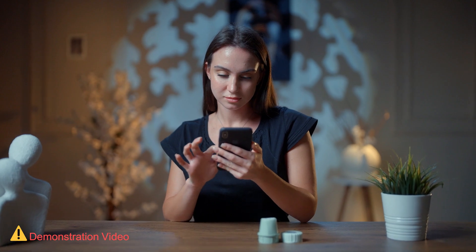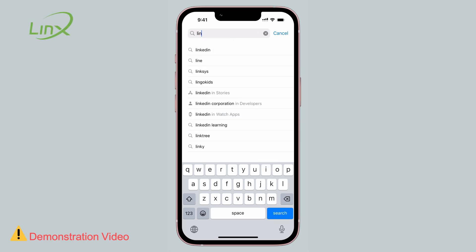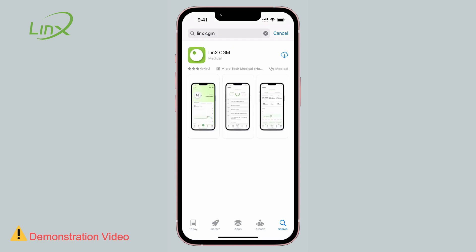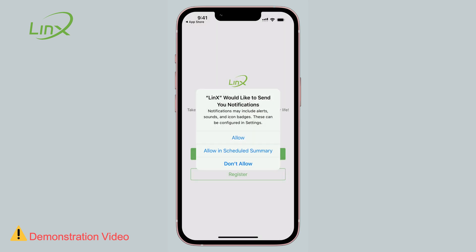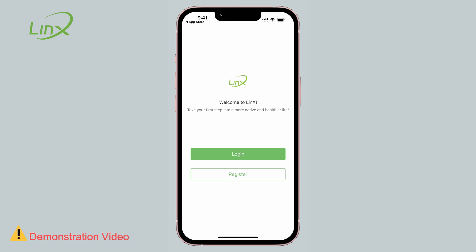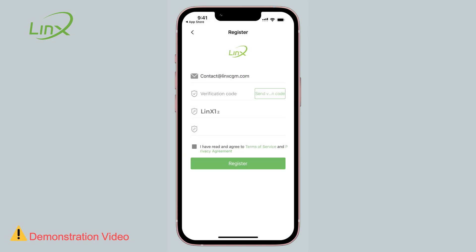Download the app and use it. First, search for the term LINX CGM in the Google Play or the Apple Store. Open the app and create an account using your email address, then select a password.